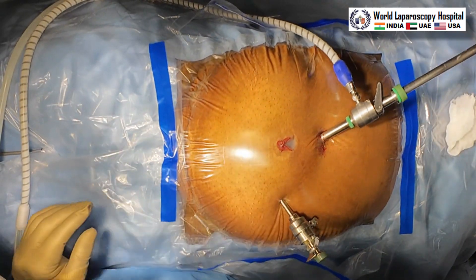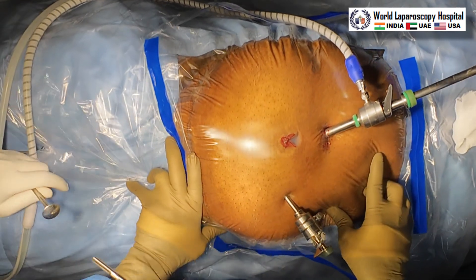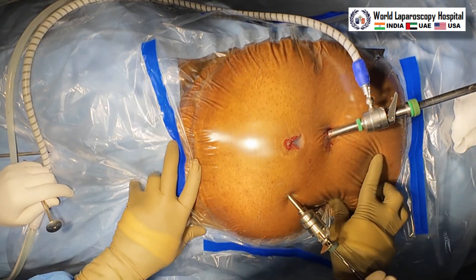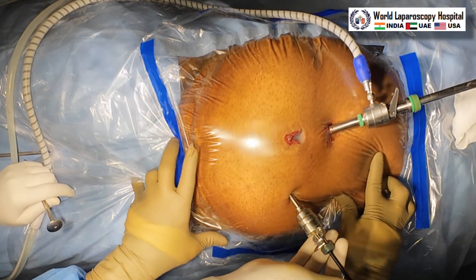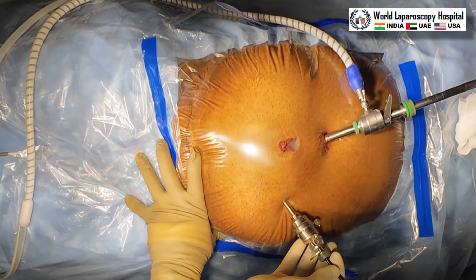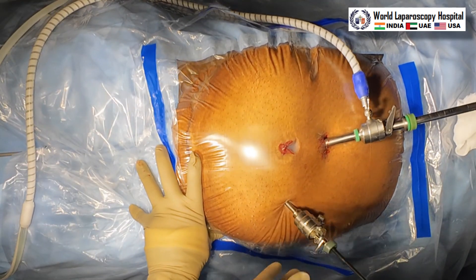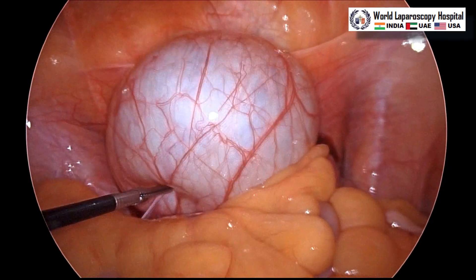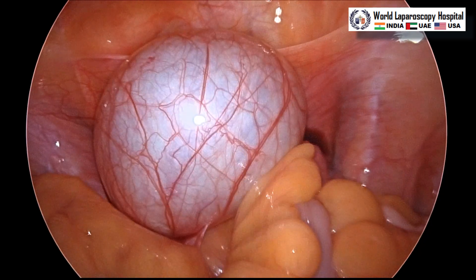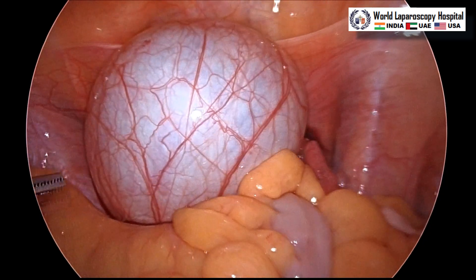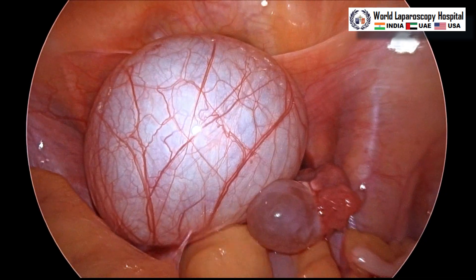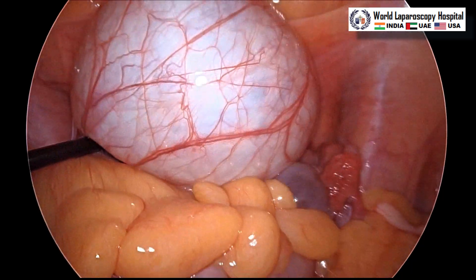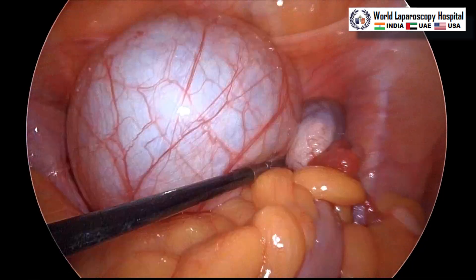This is a very simple surgery. Paraovarian cysts are very simple, and together with the appendectomy — this is an interval appendectomy which we will perform in this patient. So now we are inside. We can see the cyst which is already in the abdomen; it's floating above the uterus with left-side attachment.